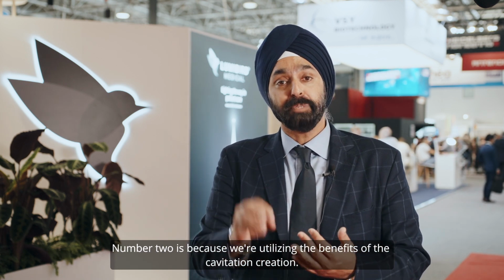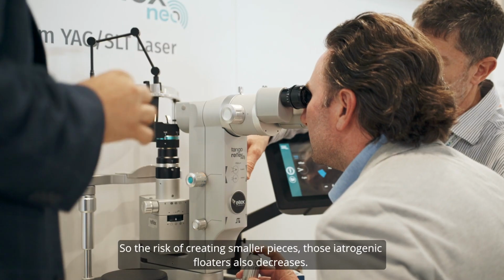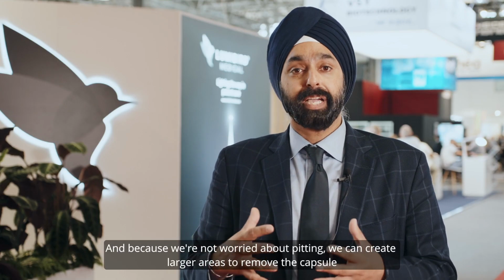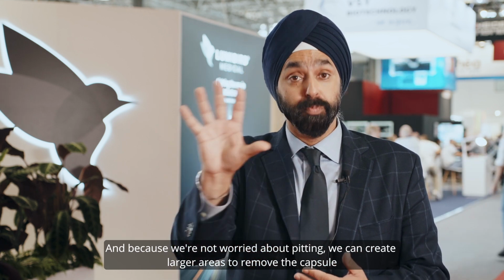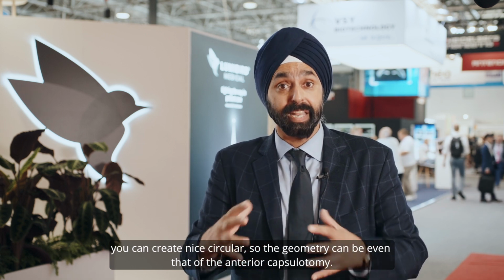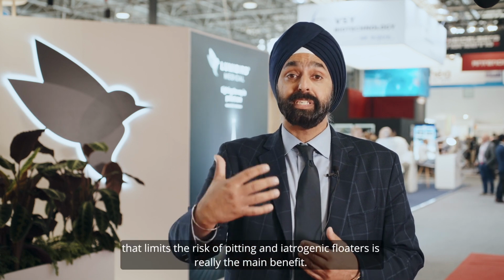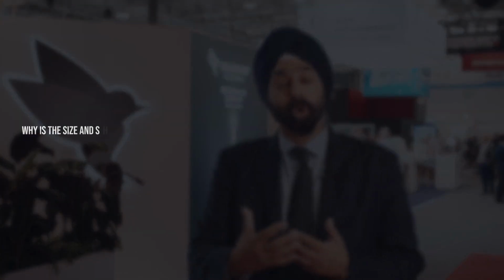Number two is because we're utilizing the benefits of the cavitation creation, so the risk of creating smaller pieces, those iatrogenic floaters, also decreases. And because we're not worried about pitting, we can create larger areas to remove the capsule. We can create nice circular, so the geometry can be even that of the anterior capsulotomy. So a large enough capsulotomy that has good geometry that limits the risk of pitting and iatrogenic floaters is really the main benefit.